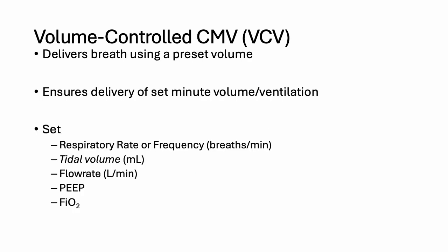Okay, so this is pressure controlled ventilation. I'm going to move on to volume controlled ventilation. Okay, pressure controlled ventilation is delivered through pressure. Now volume controlled ventilation, VCV, the breaths are delivered with a preset volume, a preset tidal volume, and the unit is usually milliliters. Okay, so this mode really ensures the set minute volume and minute ventilation. It really allows you to manipulate the ventilation because you want a certain tidal volume based on the person's ideal body weight, then you use this mode. Guaranteed delivery.